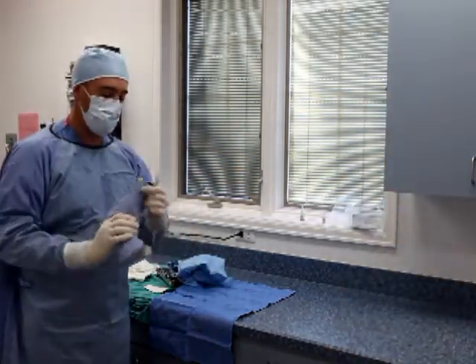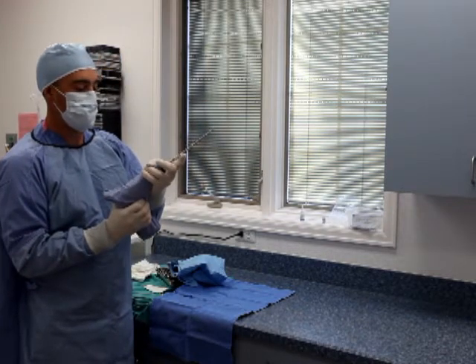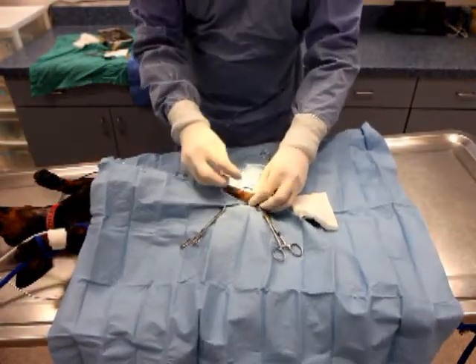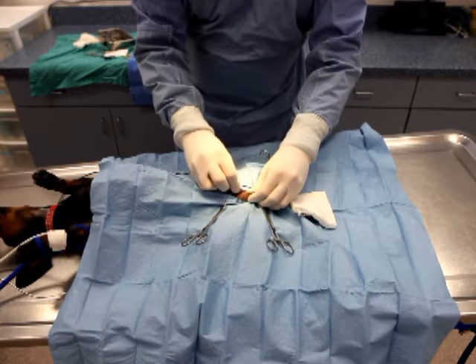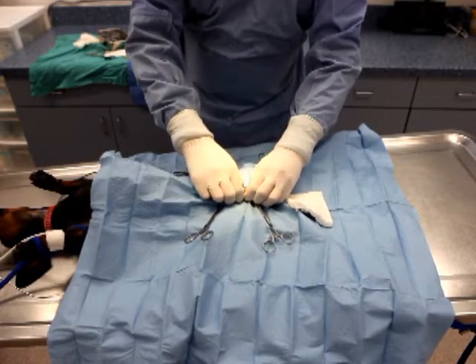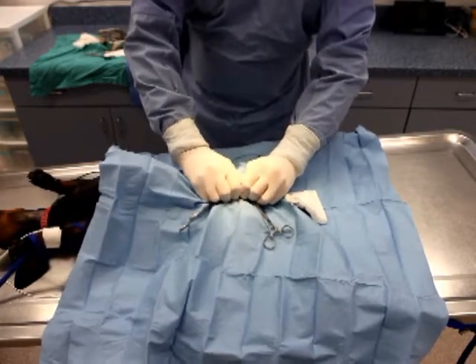While setting up for the surgery, have a technician drop the non-sterile drill into a sterile drill shroud in order to maintain the sterile field. The castration procedure is then initiated in standard fashion and performed in a closed manner, meaning that the vaginal tunic should remain intact around each testicle. This is a very important point, as the vaginal tunic provides the strength necessary for adequate twisting and subsequent hemostasis to occur.